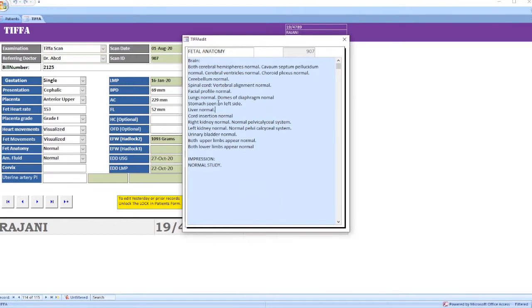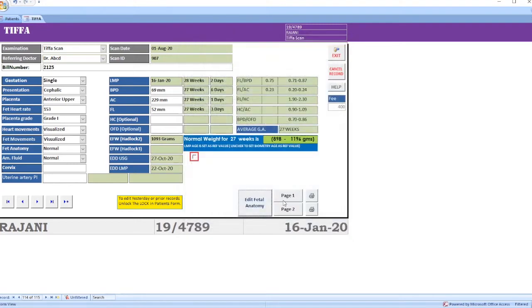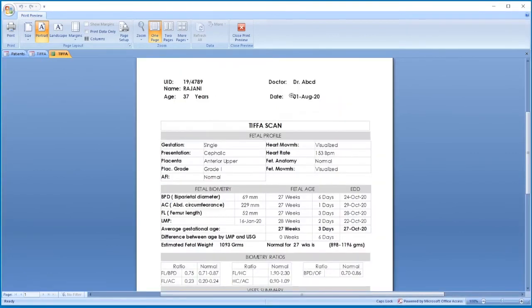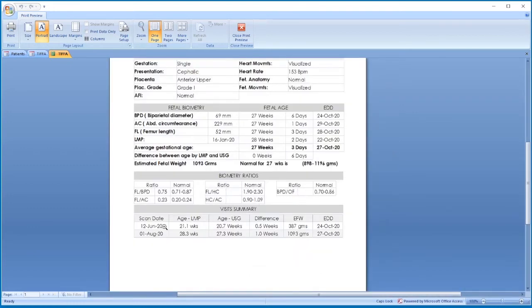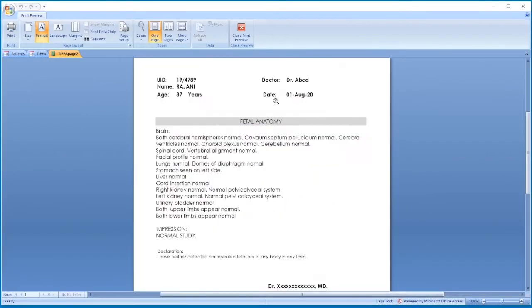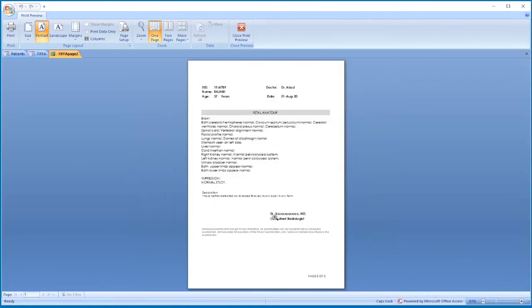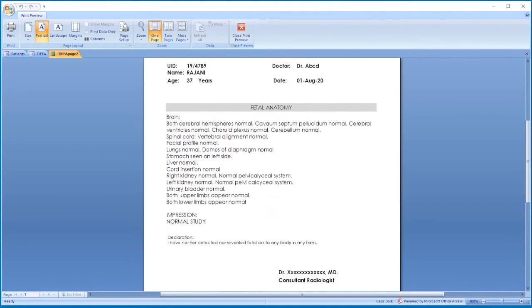For 27 weeks of gestation, the normal weight is displayed here. Then go to fetal anatomy. This is a fetal anatomy template — if there is any abnormality you can edit this, then close it and print. This is the report of a TIFFA scan showing patient details, fetal profile, fetal biometry, fetal age, EDD, estimated fetal weight, normal weight for that gestational age, fetal biometry ratios, and visit summary.